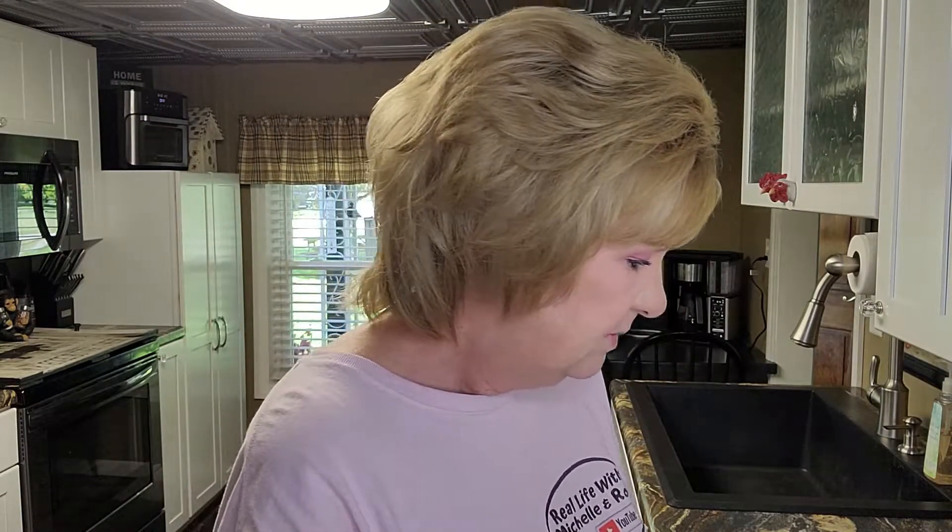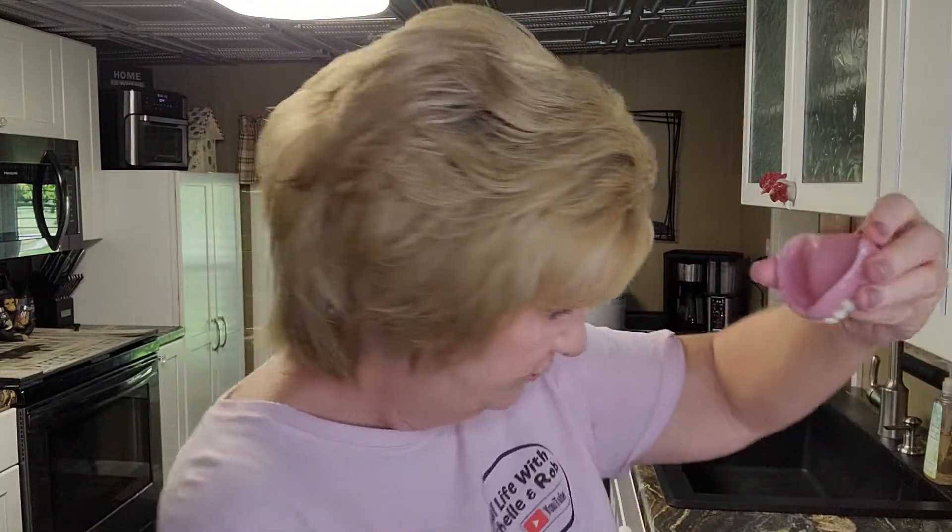Let's open up this Equate brand — the Walmart store brand. I'm hoping this one isn't as stiff. It is a bit stiff, but I don't mind that for inside my denture. It's a little stiffer than the Amazon one, but look how it fits in the trough — it gets in there really, really good. I like this one.